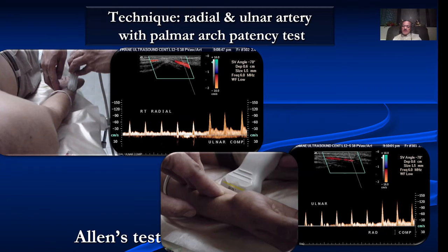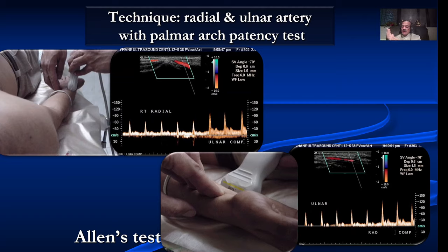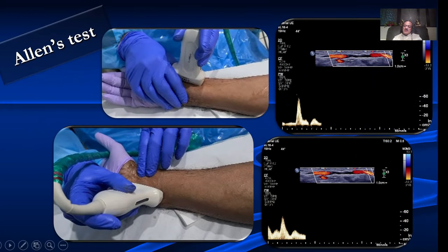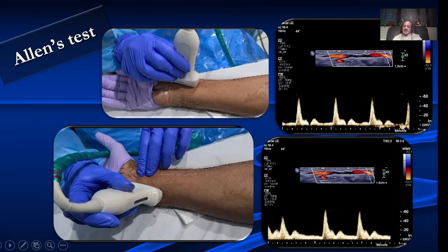There are some tests which we need to do in the upper limb. One is Allen's test, done to assess palmar arch patency — to find out if the palmar arch is patent before we take the radial artery for bypass surgery. We look at the radial artery, compress the ulnar, and look for an increase in velocity. Then we look at the ulnar, compress the radial, and again look for increasing velocity. This increase in velocity should be at least 30 to 40 centimeters per second.